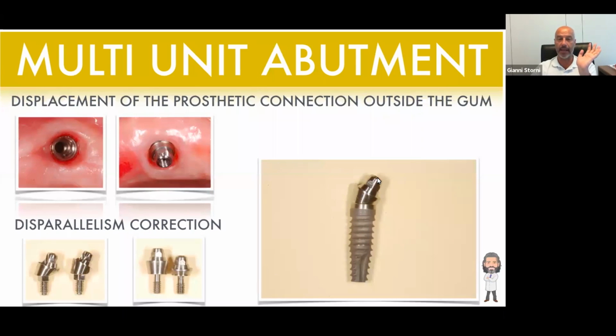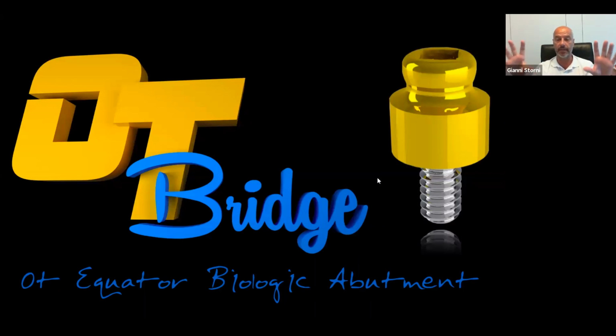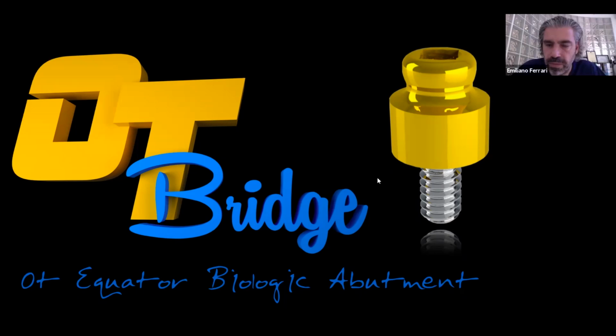Emiliano, just back. This is important for those who already know our solution. From here, there is really something new that helps you to use a removable attachment, as it is today, in a simple way as an attachment to retain a fixed bridge, all on 4, all on 6. So you can do all kinds of rehabilitation.